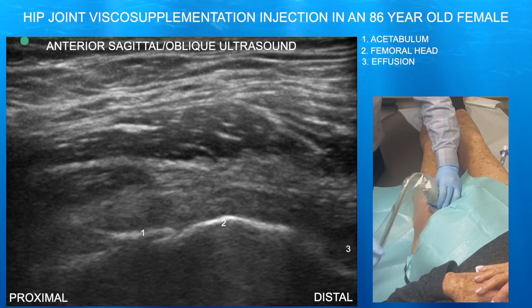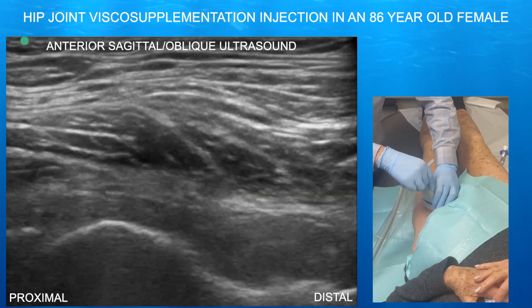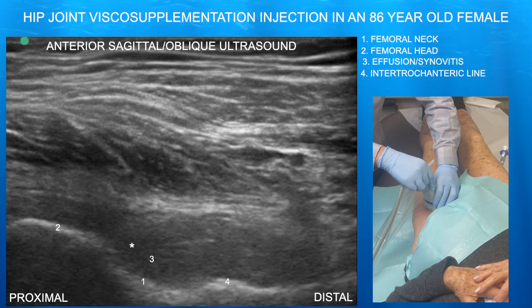Here we are looking at her hip joint. You can see essentially bone-on-bone arthritis where the acetabulum is essentially abutting into the femoral head. You can also appreciate a CAM lesion.